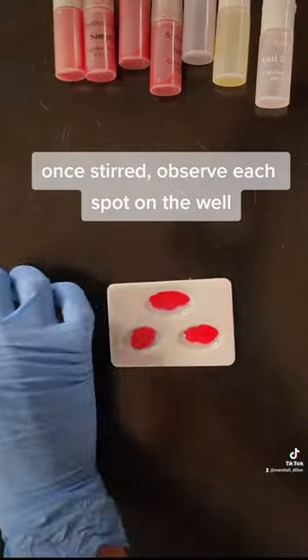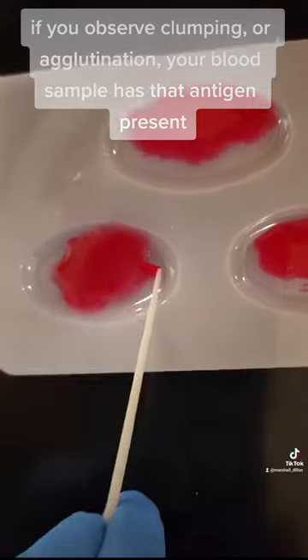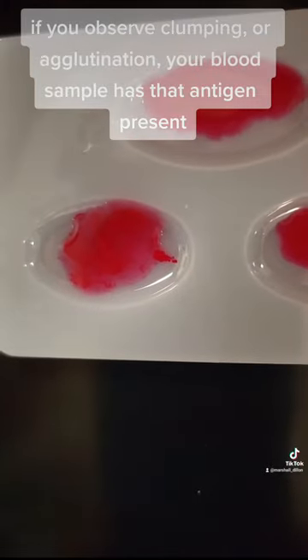Once stirred, observe each spot on the well. If you observe clumping or agglutination, your blood sample has that antigen present.